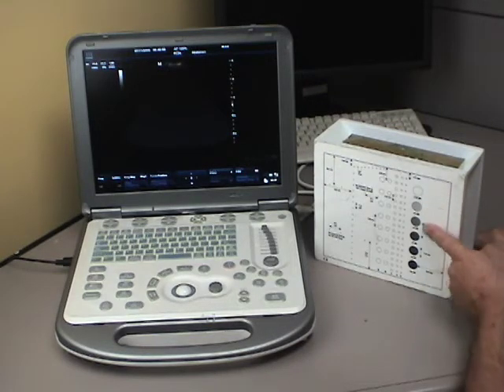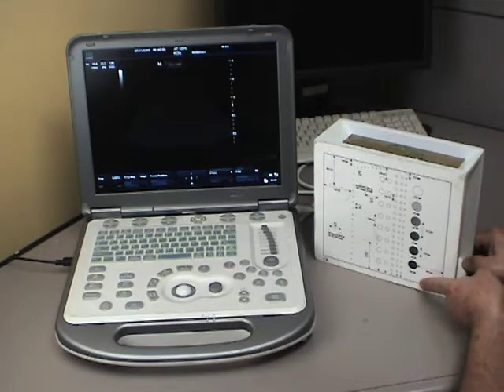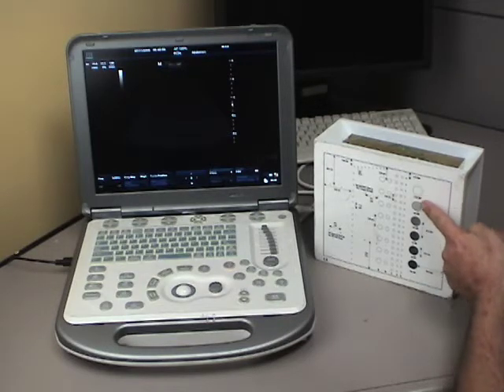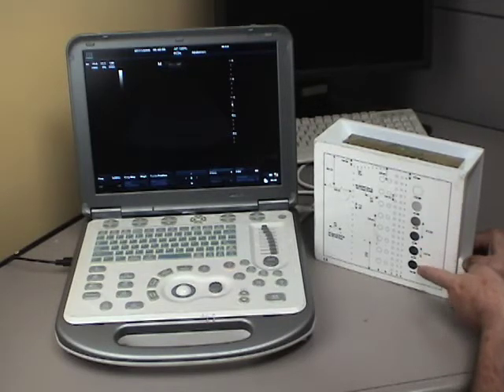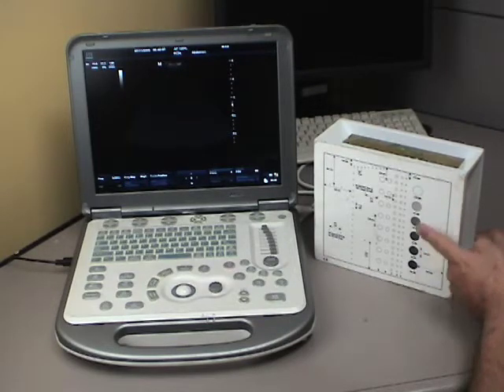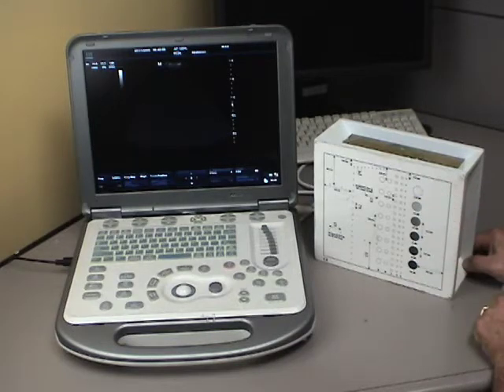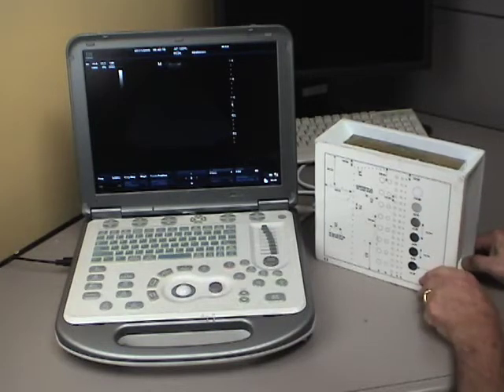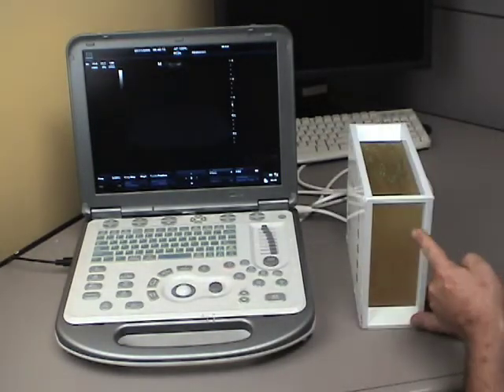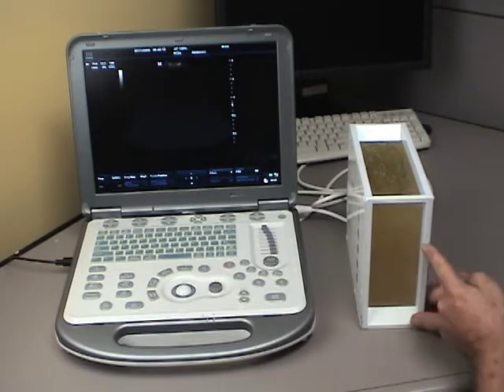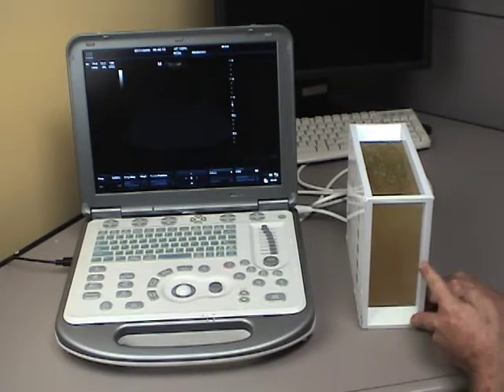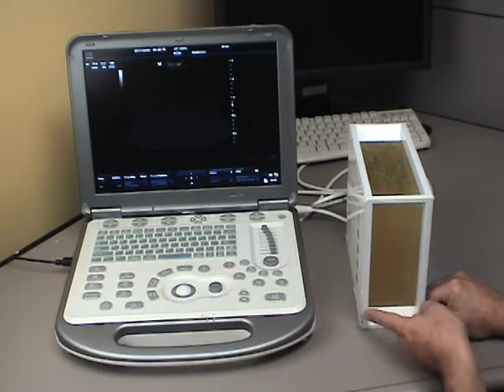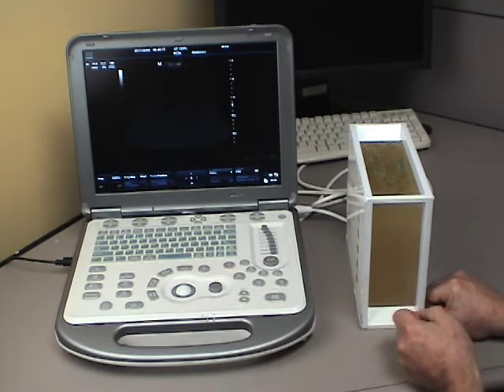This phantom, you can see, it's got a diagram like all of them do on the outside, showing you what's inside the phantom. Here you'll see a series of rods that are going from light to dark, and they appear as circles on here. In fact, that's actually a plexiglass rod going sideways through the image this direction, and I'll be able to show that to you when we're scanning.